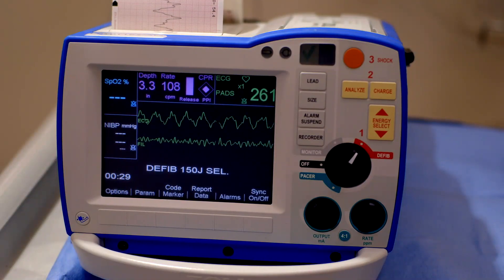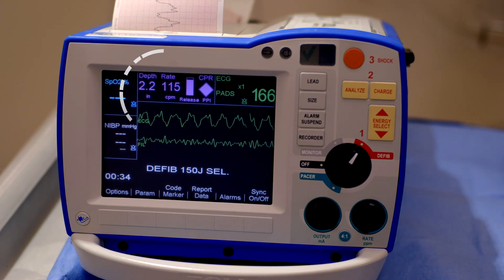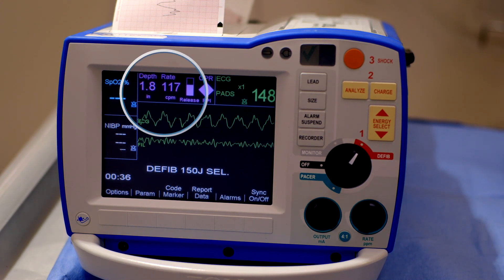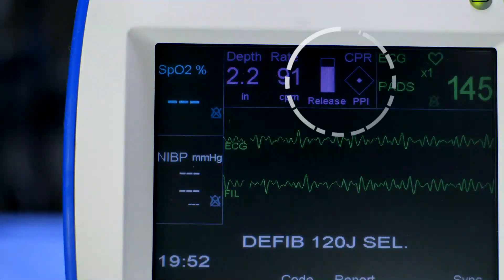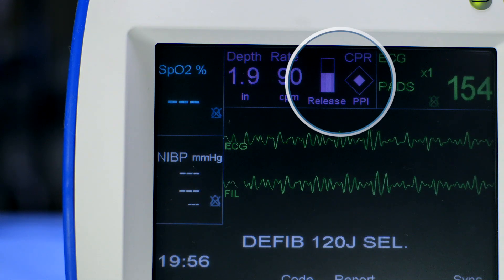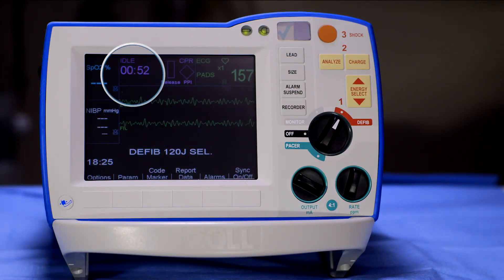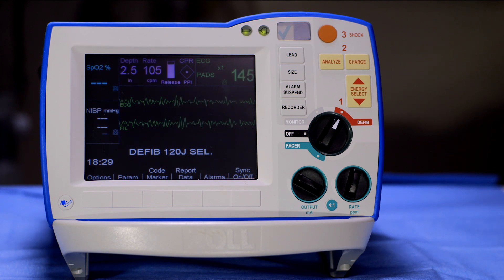For adult patients, real-time feedback displayed on the CPR dashboard includes compression depth indicator, compression rate indicator, release bar, perfusion performance indicator (PPI), audio and messaging prompts, and idle timer. The CPR dashboard on the R-Series defibrillator provides you with a digital reading of each and every chest compression.